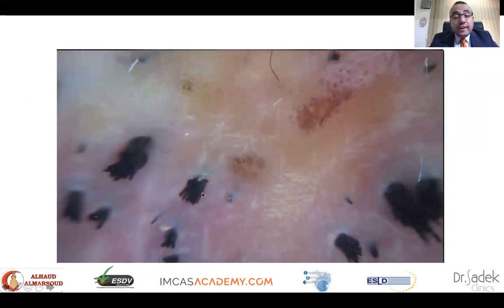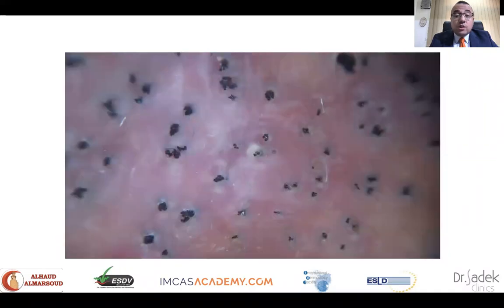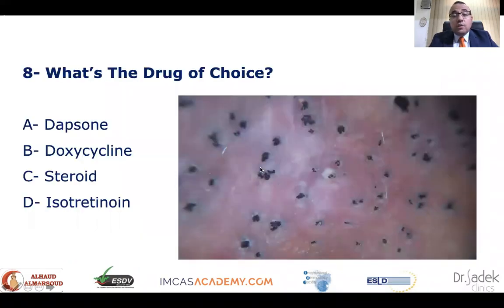There is tufting of more than 10 hairs with this starburst appearance in between and the epidermal reaction with diffuse inflammation and erythema. And assessing other parts, there is diffuse cicatrization and there are follicular pustules as well. So this is a case of folliculitis decalvans.